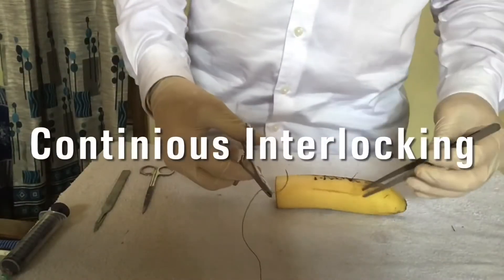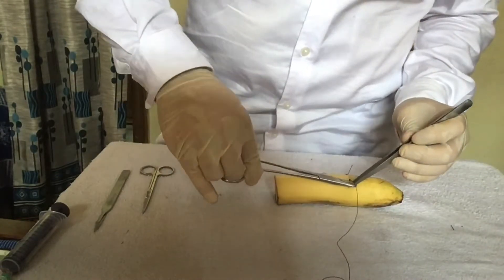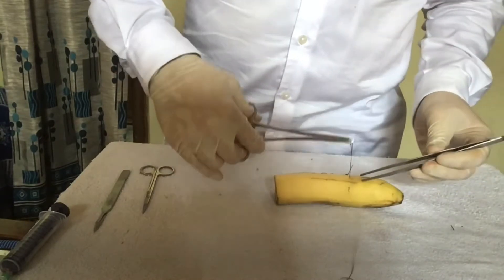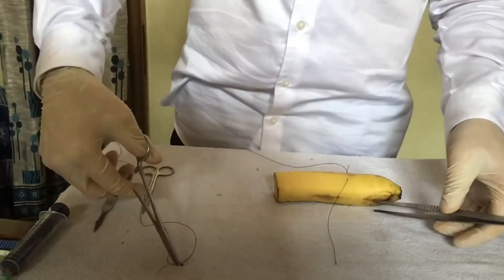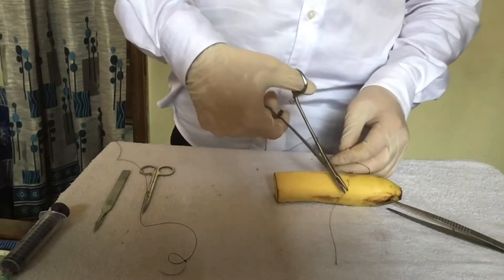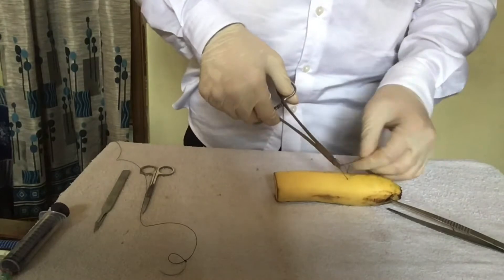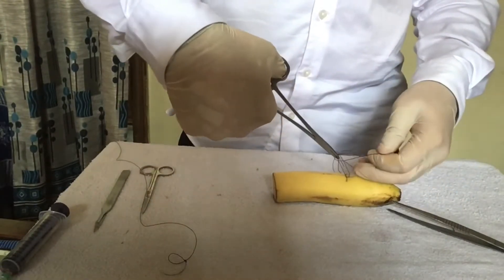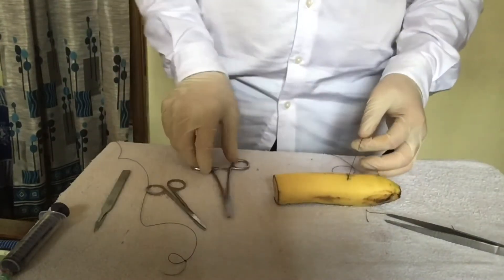Now cut the extra suture — the continuous suture is done. For continuous interlocking suture, follow the same first step as taught before and tie a knot. Here I am using the needle holder to tie a knot. When you are done tying the knot, cut the extra suture from the short end.